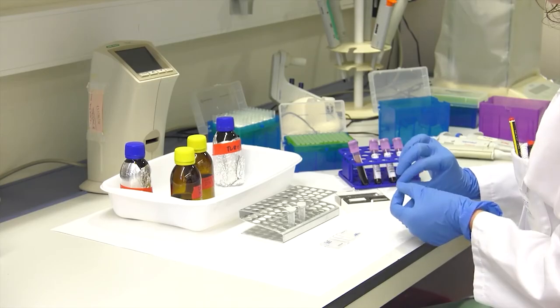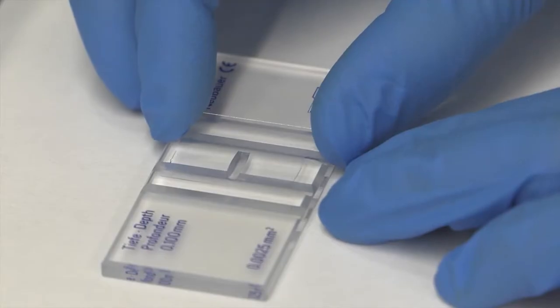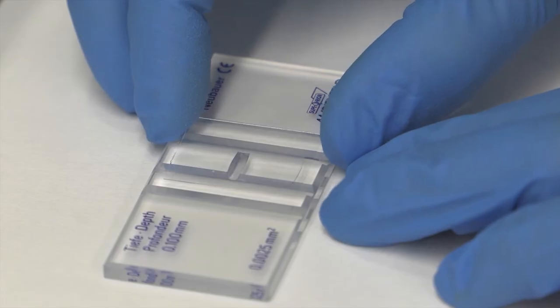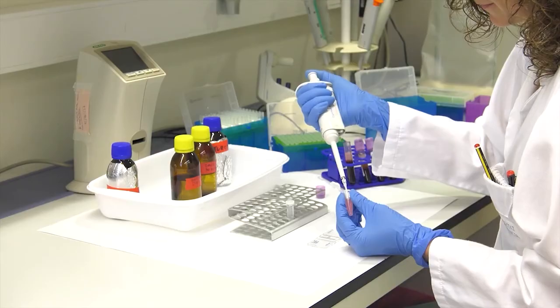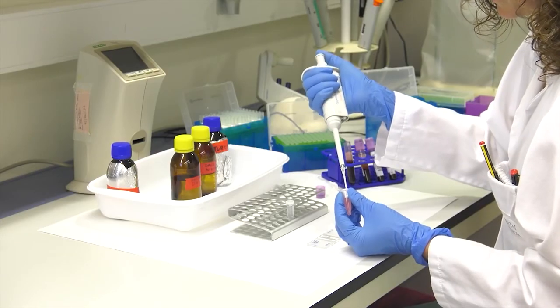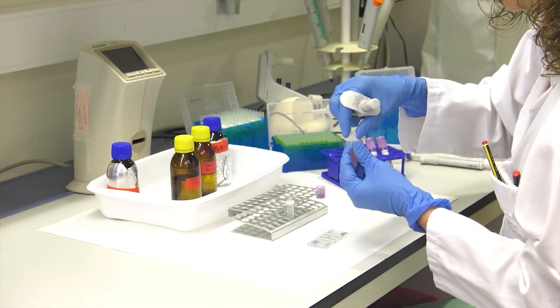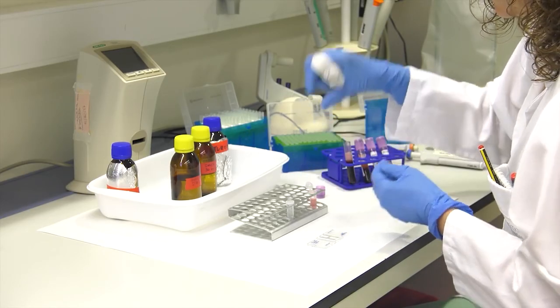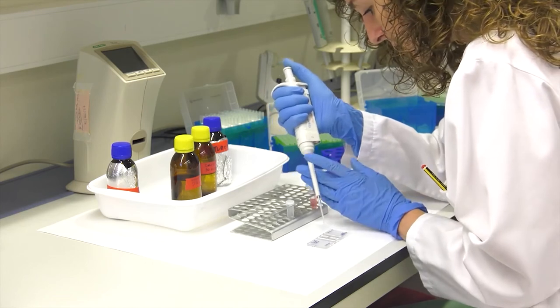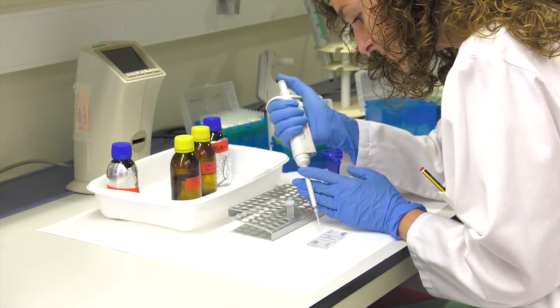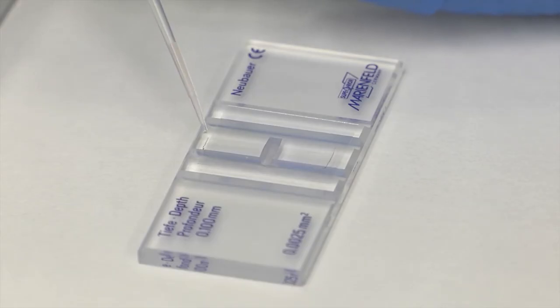After dilution, and with the chamber clean, place a coverslip on the surface of the chamber. With a pipette, take 10 microliters of the diluted blood sample and deposit it little by little in the central area of the chamber, placing the tip of the pipette on the upper or lower side of the coverslip, and introducing the sample gently to prevent it from overflowing or producing bubbles.